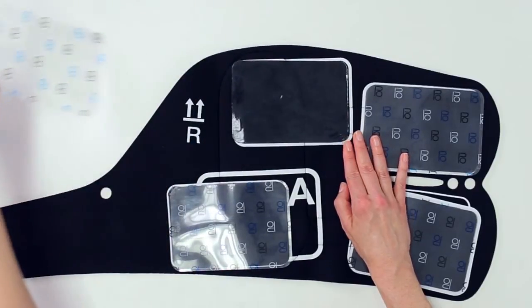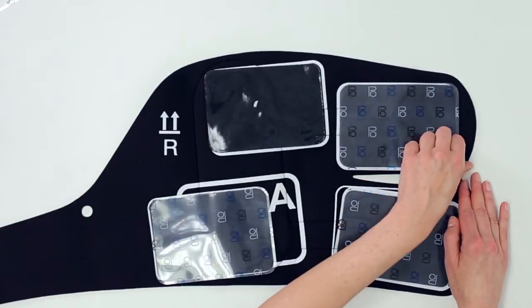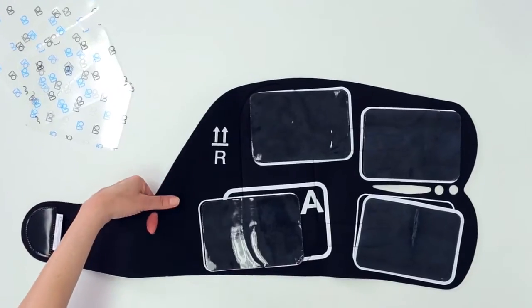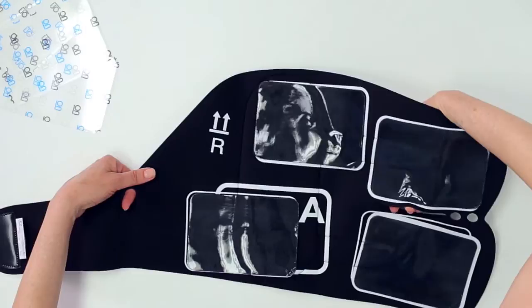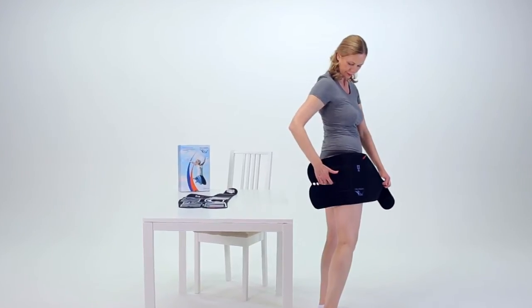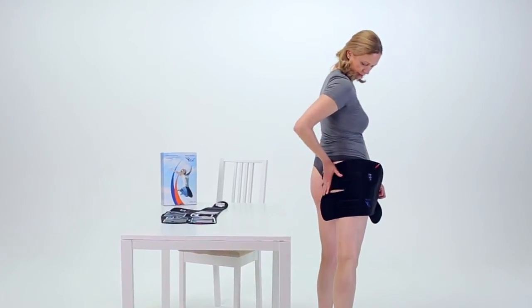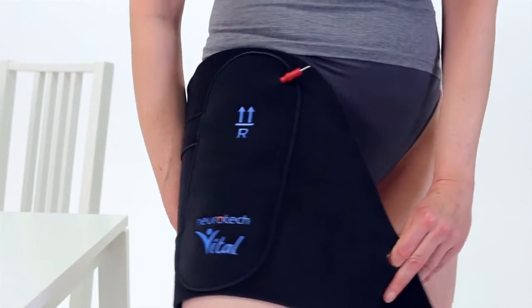Put the liners somewhere safe so that you can reapply them after your treatment session. To put on the right garment, put the left index finger in the small hole and then the tips of the fingers of your right hand in the slit on the garment. Ensuring the electrodes are facing your body, guide the tips of the fingers of your right hand towards the crease of your buttock. Once you have located the position, you can apply pressure to the garment on your buttock and on the back of your thigh.